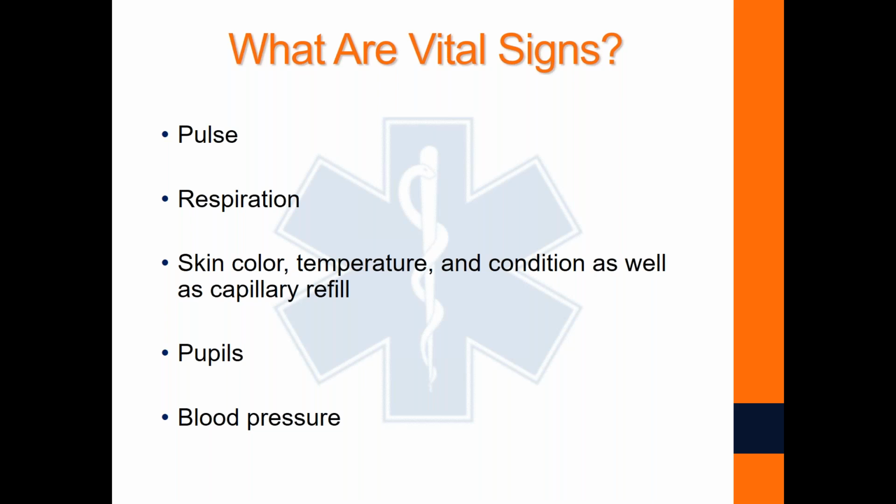It should be very brisk and quick. This is a particularly handy tool for children more so than adults. We don't generally, if our patient's under, depending on what it told you in the book, it's normally either 1 or 3 years of age. We don't really do a whole lot of blood pressure monitoring on children. It's difficult to obtain. Kids are awful fidgety.